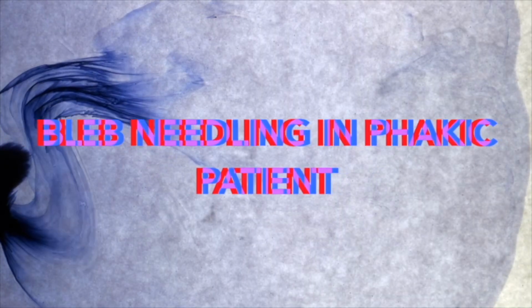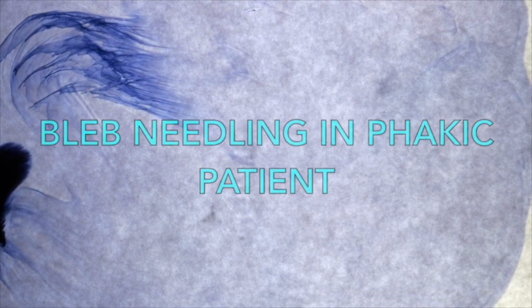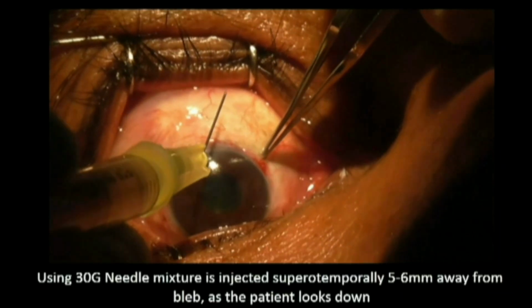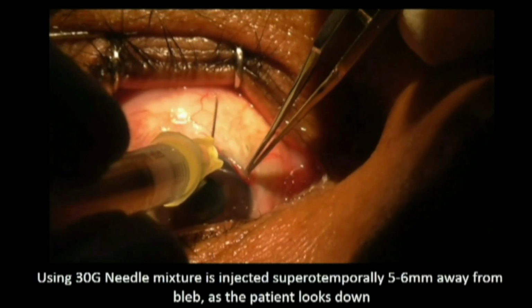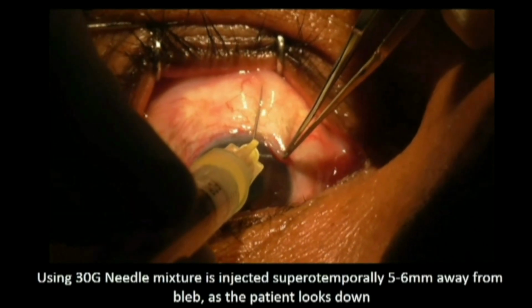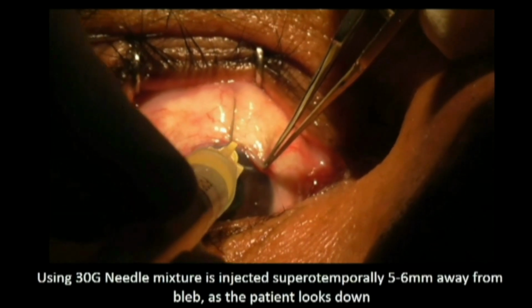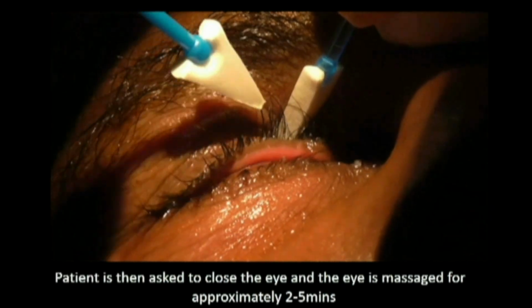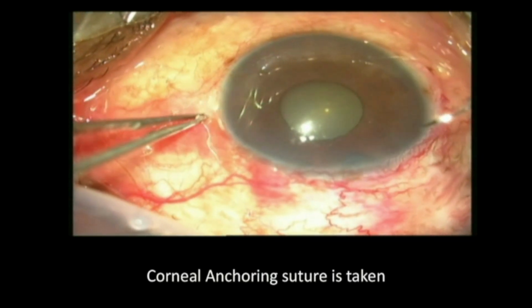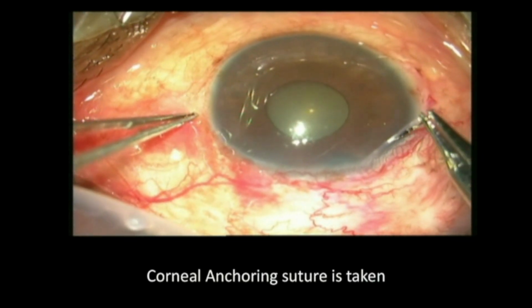Now let's see a case of bleb needling in a phakic patient. Using a 30 gauge needle, a mitomycin C mixture is injected superotemporally 5 to 6 mm away from the bleb as the patient looks down. The patient is then asked to close the eye and the eye is massaged for approximately 2 to 5 minutes. A corneal anchoring suture is taken.